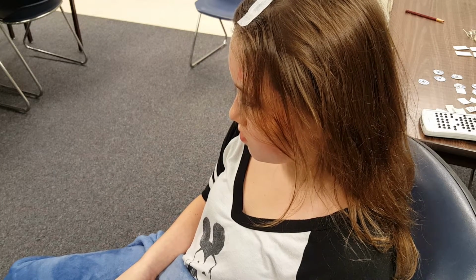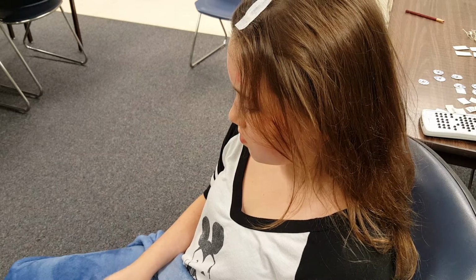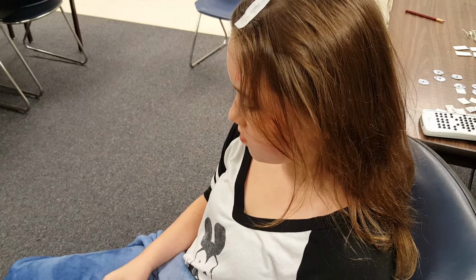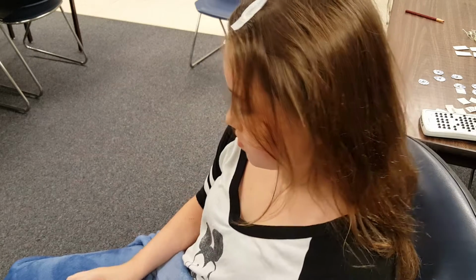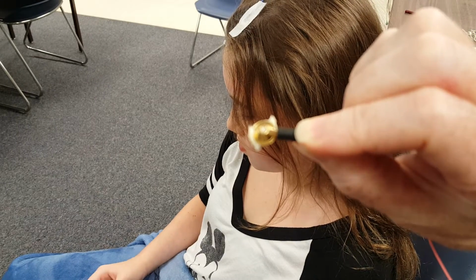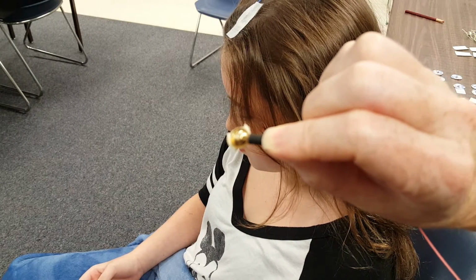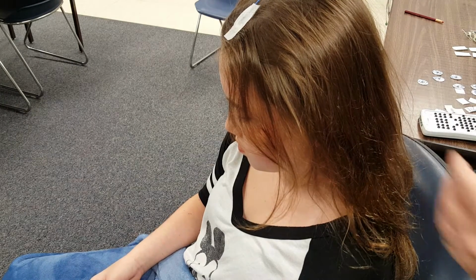Okay, I have put most of our electrodes on already, but I'm going to show you how to do a couple here. So I have my electrode and I've scooped some paste into my electrode here. So that's the top of it. It can autofocus. And then I just filled the cup with some electrode paste.